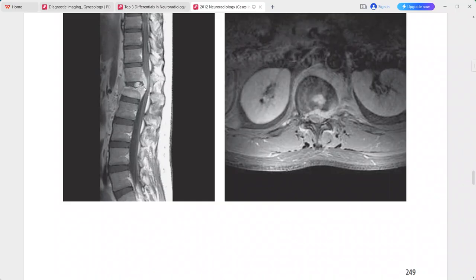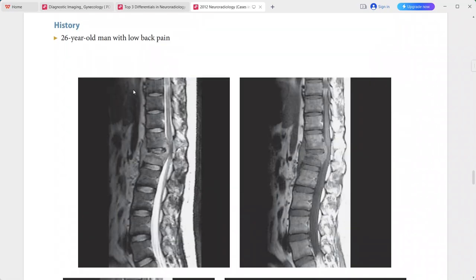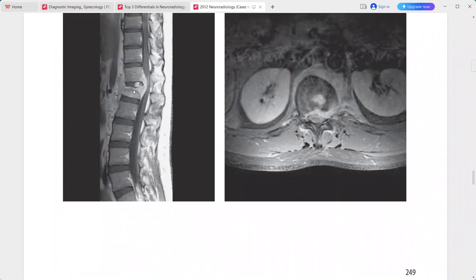The posterior aspect of the intervertebral disc contains enhancing material, but its involvement is less extensive than that of the vertebral bodies. This is a typical case of tubercular spondylitis. In the differentials, you can include pyogenic spondylitis, metastatic neoplasm, lymphoma, or myeloma.